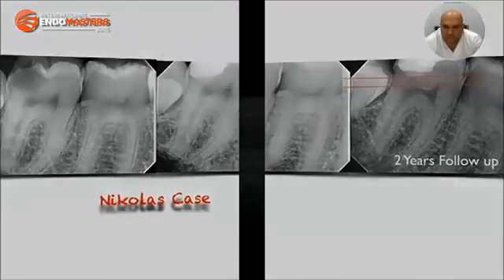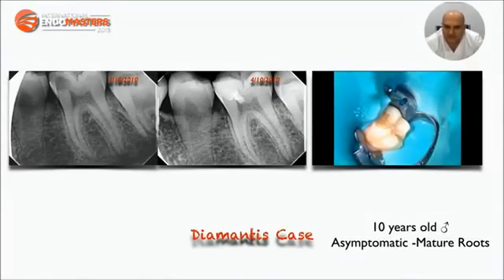Diamandis' case here: deep carious lesion with pulp exposure. Diamandis was referred for root canal treatment of his first mandibular molar back in 2010. And although root canal treatment was a very predictable treatment approach, I again selected MTA partial pulpotomy for this 10-year-old boy, with exactly the same clinical techniques.